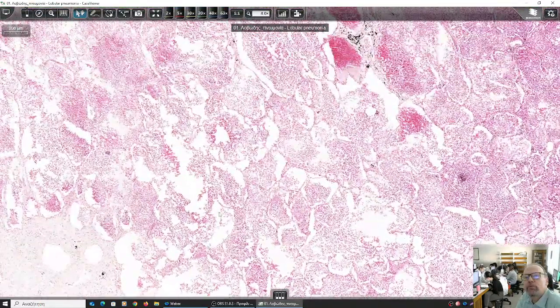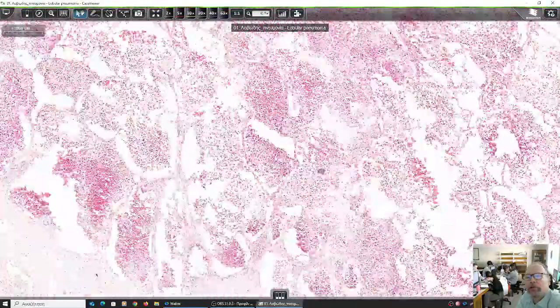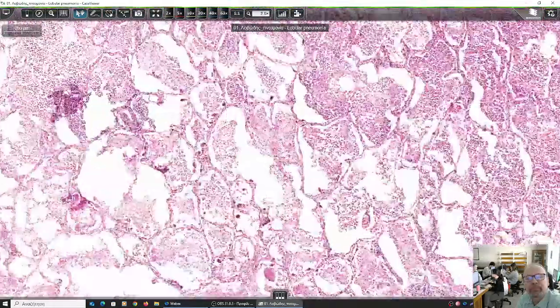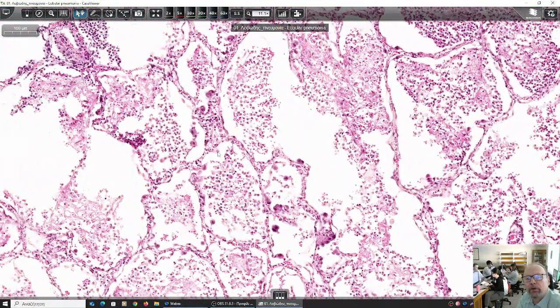Perhaps the tissue can help me decide what medication will be suitable for this patient. Are there any peculiar cells here? Who can come and show me the cells? Right there from the outer part. Can you come here and show me the cells? No, not you. The corner. Come here, please.